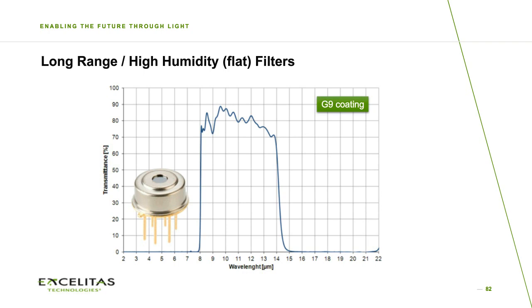Typically, you will have to get close to the person. So please don't believe that you can measure a person over several meters with a very high accuracy. It will be very, very difficult to achieve.